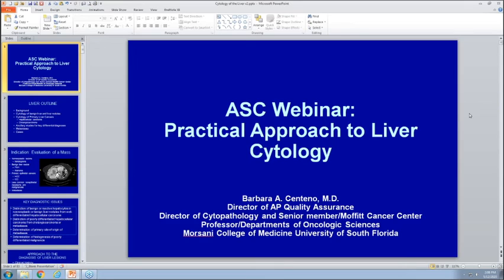Here's another question from one of the participants. Should we ever mention the possibility of dysplastic nodules in cytopathology reports? Or if you do, how do you do that? Like small cell dysplasia or large cell dysplasia? Do you ever put that? Right. So I didn't review that in this lecture.